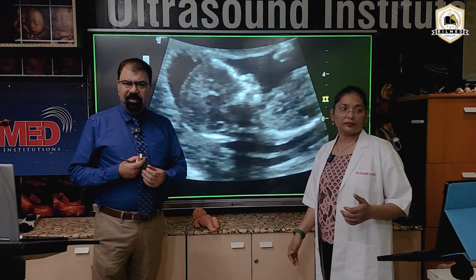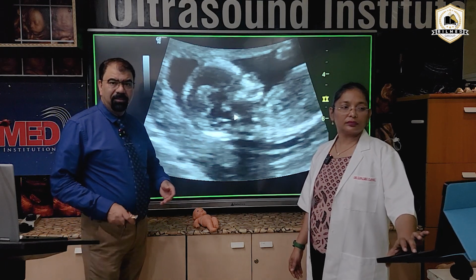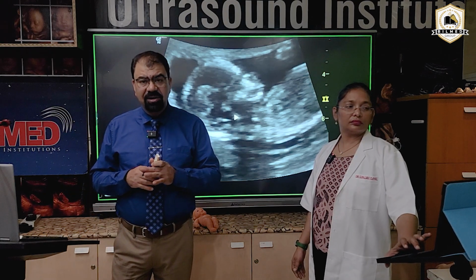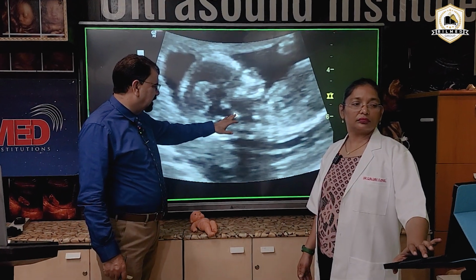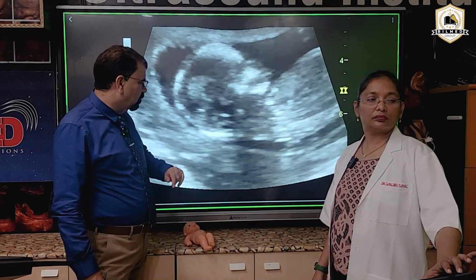Why is this important? Because in spina bifida, I will not be able to see an intracranial translucency. This ICT, this fourth ventricle, will be obliterated. So this is why we look at the intracranial translucency. We will take it in detail. So first, we are giving a small teaser over here.